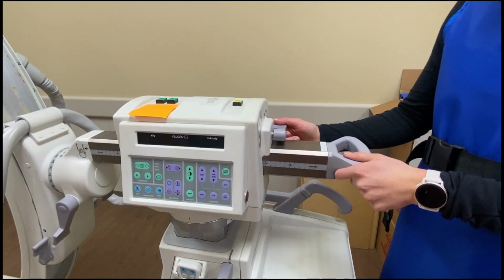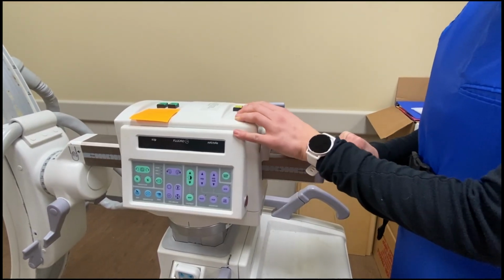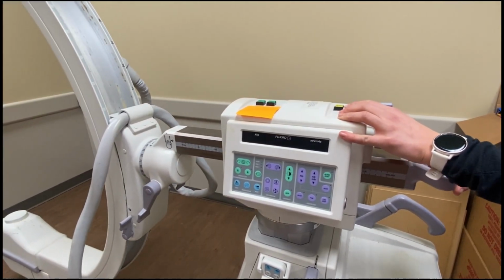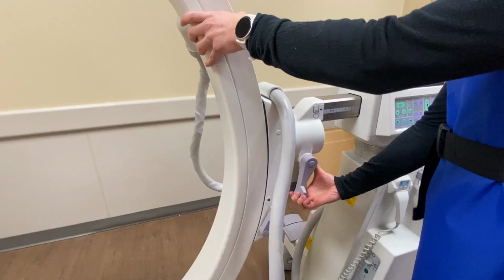The in and out lock has a full length of 20 centimeters. Before the surgery begins, you want to make sure to set it at 10 centimeters so you have room for adjustments with just moving the arm in and out of the field without having to move the entire C-arm.